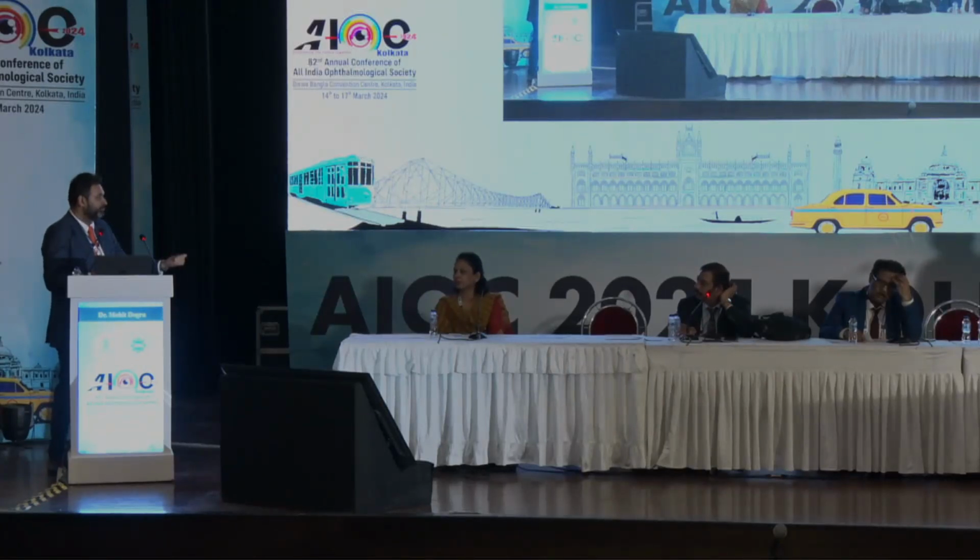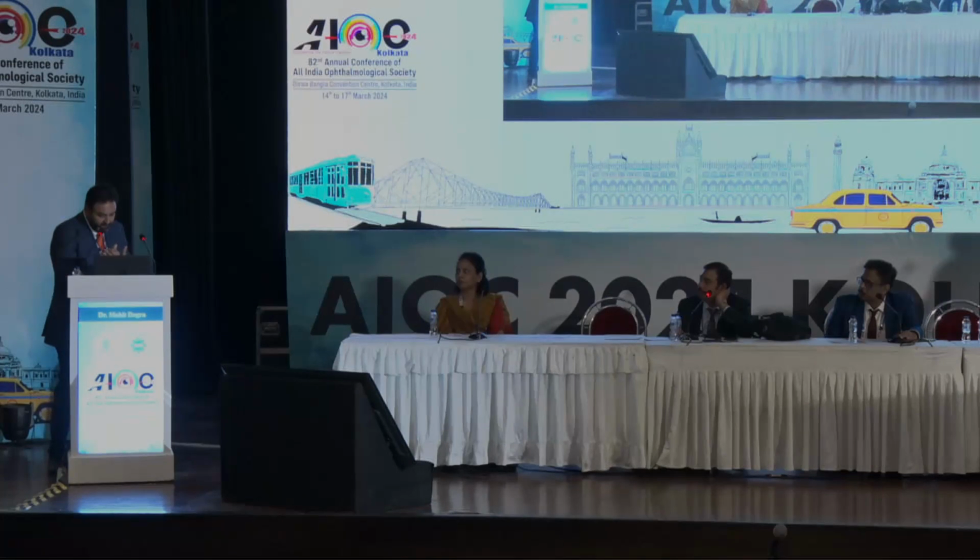Yes, the patient had no vision, but that's subjective. Yes, the patient gained some vision, that is also subjective, and the patient has an attached retina later on. If there's a medicolegal case, you can always take a photo then. But if you do not have documentation prior to that, you could be dragged into court. You could have other things going on. Was surgery necessary? Was there a break? Was there just hemorrhage that cleared? So, documentation from that viewpoint.